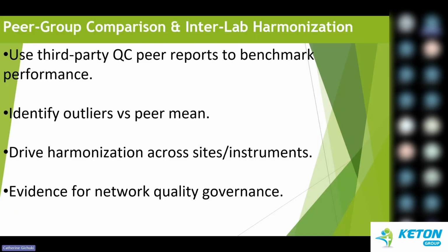Provide governance evidence. Peer group reports, like we have said, serve as proof to management and auditors. When an auditor is coming to your lab, and you're saying that you're comparing your results, you're having peer group report comparisons. Of course, you will have very good evidence that you're on top of the game, your QC system is on top of the game, and the lab network is monitored and harmonized. You have evidence to show that.